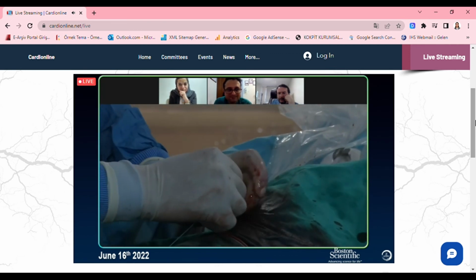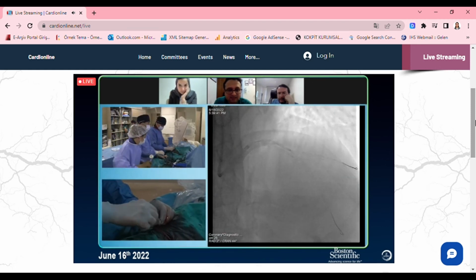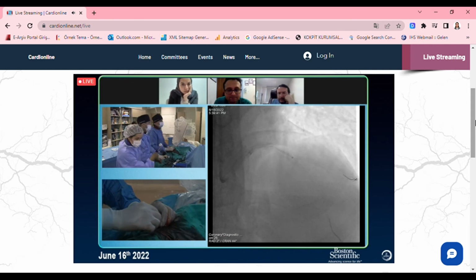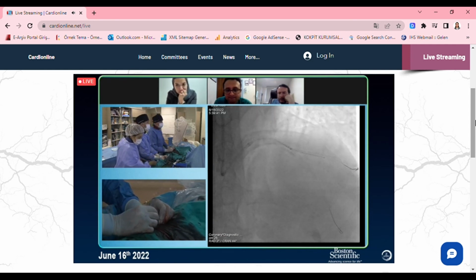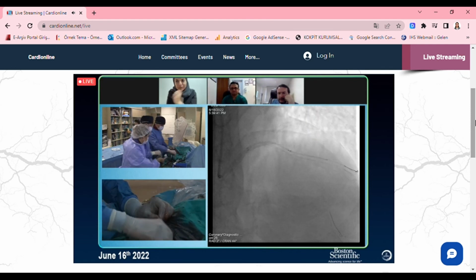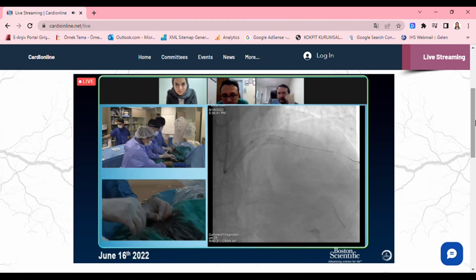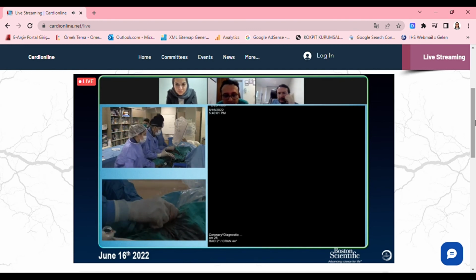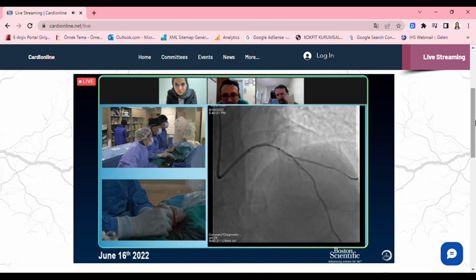Now I'll do clot, guys, here. Clot, okay? What size stent are you using now? 3.5, 2.5. Yes, 2.5, sorry. Yes, remove. All right, let's see. Small injection, not much. Yes, we have dissection there. Very gently. Very gently. All right, this is nice.